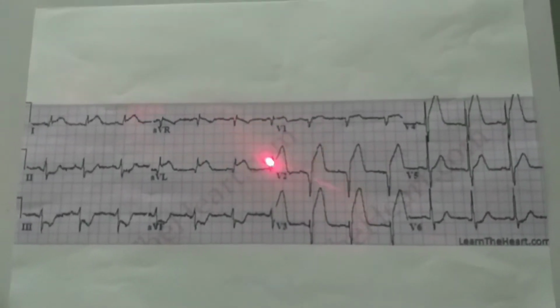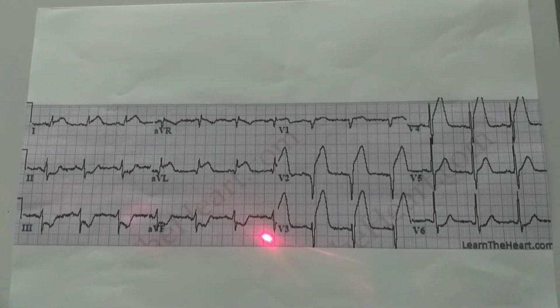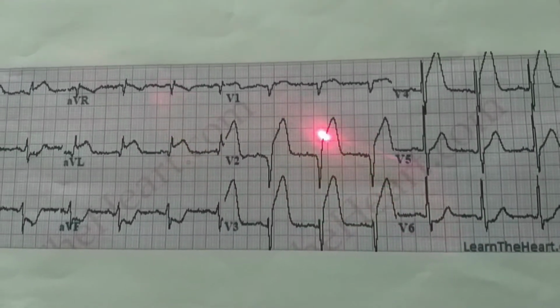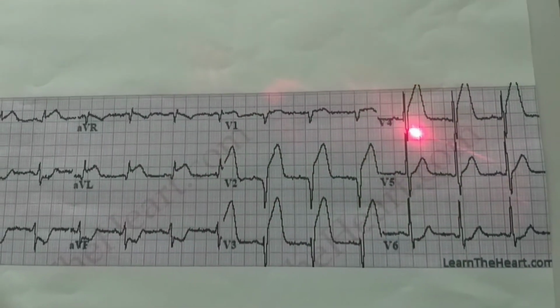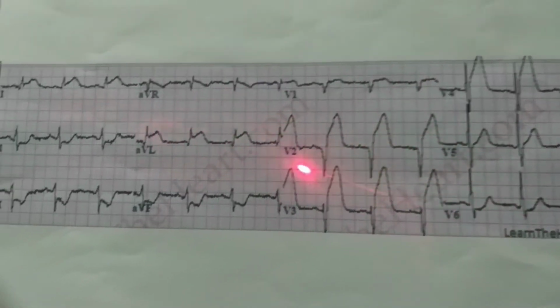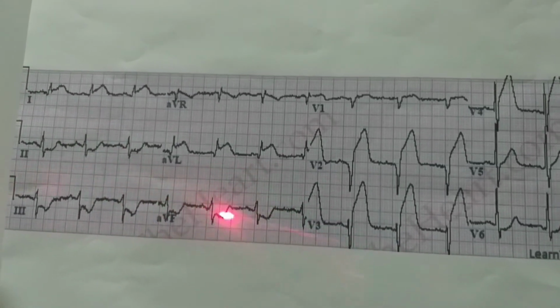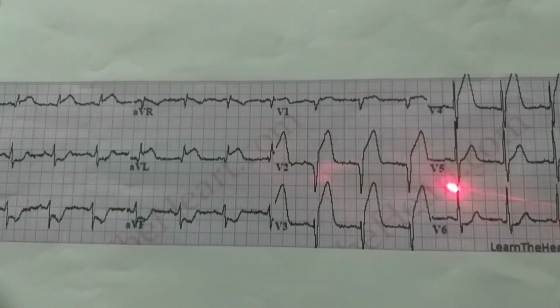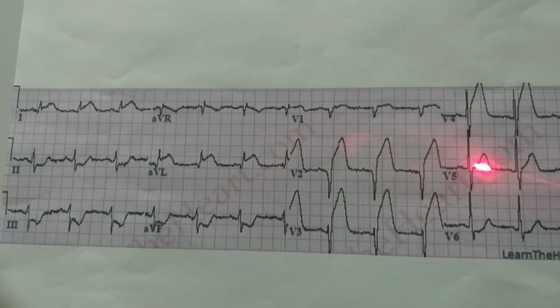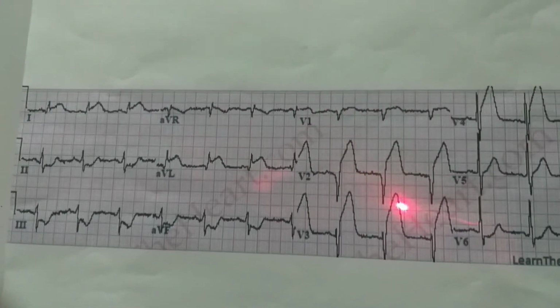Another example of an ECG, where the patient presented with chest heaviness, and when the ECG was obtained, if you look very carefully, you will see a very prominent ST elevation in leads V2, V3, V4. So this is a pure anterior wall ST elevation MI. You will find the reciprocal changes in leads 2, 3 and AVF. There is ST depression, but the primary change of this ECG is ST elevation. So this is known as anterior wall ST elevation MI, and probably the culprit artery seems to be the left anterior descending.